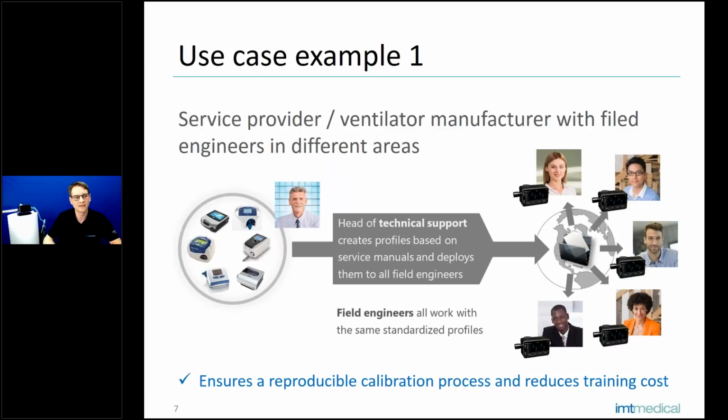And this technical support director can then create profiles for the CITREX devices of the field engineers. He can do this based on information of the service manual, which he can find in the service manual of the equipment to be calibrated in the field.